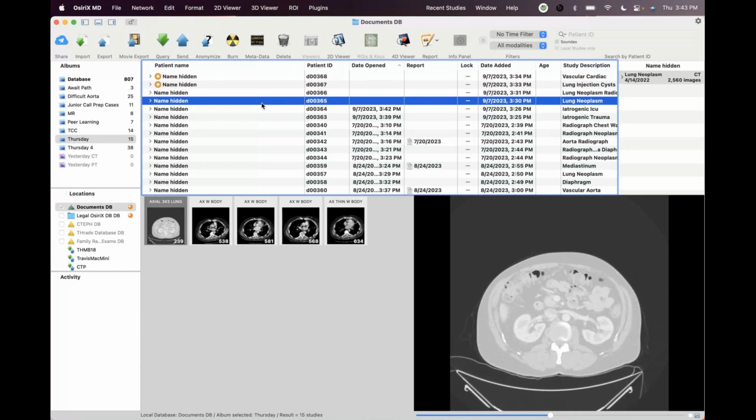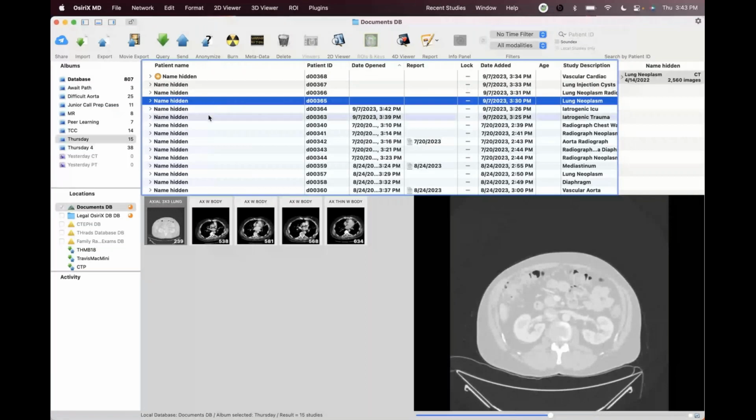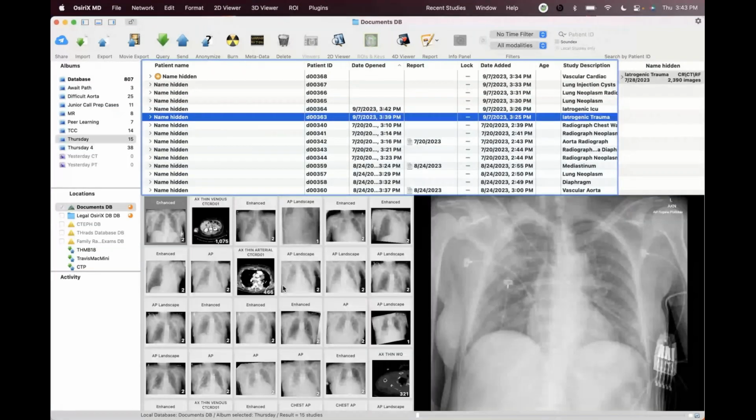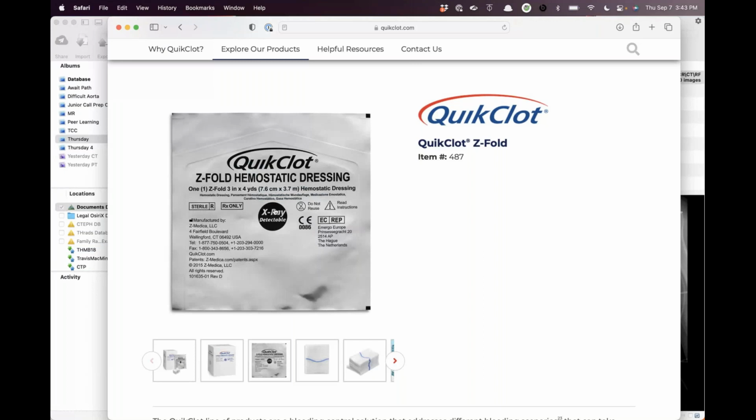Okay. But Travis, did it look like a set of sponges? Was that a stack of sponges that the manufacturer's illustration had? No, you picked up one single piece. It's like a cube then. This is why they call it a Z-fold, because it unfolds into something, and you can see the dimensions here. It's 3 inches by 4 yards. So the idea is you pack the whole thing in, or do you cut a piece? That was part of the discussion. There are a lot of institutions that don't allow these to be cut because I think they've had similar issues in the past, and that was part of the discussion here.